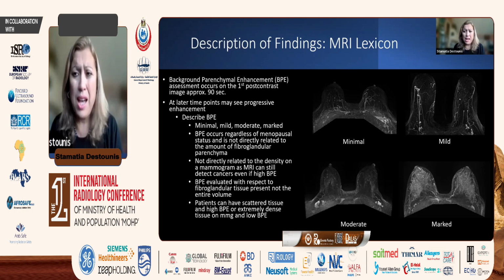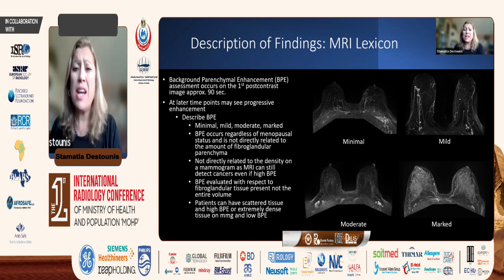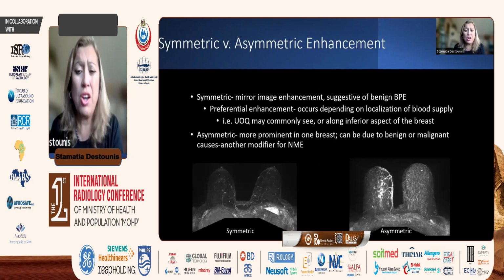We know that high density in a mammogram makes the mammogram less sensitive, but with MRI, even when we have marked BPE, we're still able to identify cancers. So we know MRI is different, and BPE doesn't work the same way as breast density on the mammographic imaging.